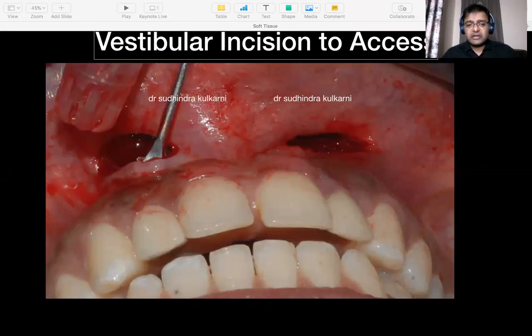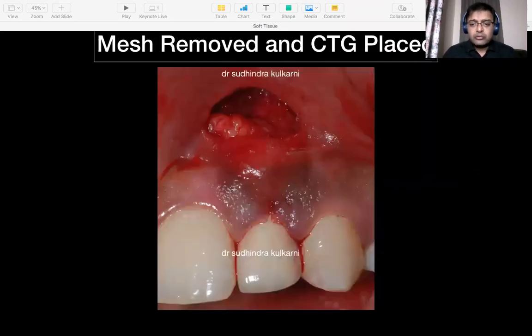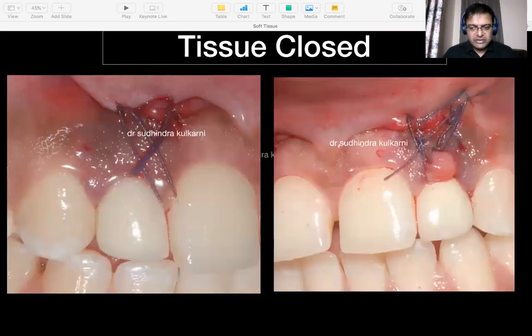So what we did was, we did a vestibular incision, removed the titanium mesh, and then tucked in. I wouldn't leave this surgical site without any graft. So we tucked in connective tissue on both sides. You can see here on the 1-2 site as well as on the 2-2 site. In the 2-2 site, we had a small fenestration in the gingival margin, and so that's why the mucosa came out. The connective tissue is a bit exposed, but it was tucked and sutured on either side.